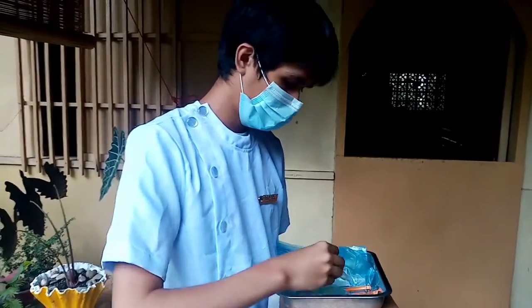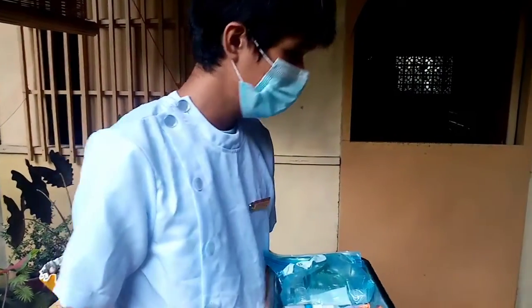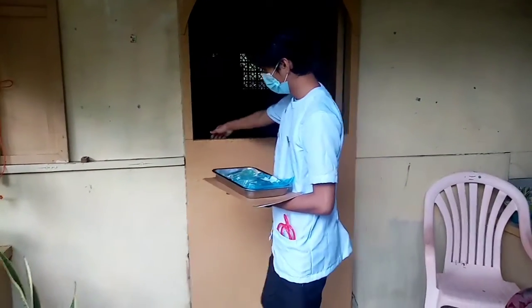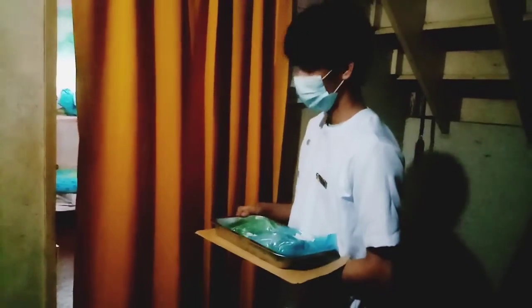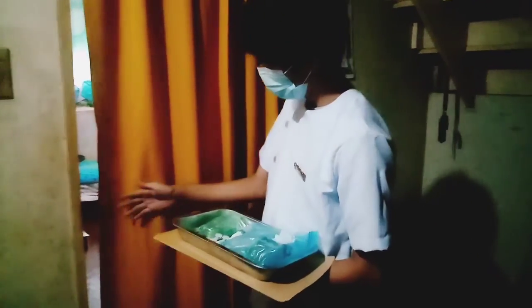Place the medication on a tray or move the medication cart outside of the patient's room, or prepare for administration in the medication area. Transport medications to the patient's bedside carefully and keep the medication in sight at all times.